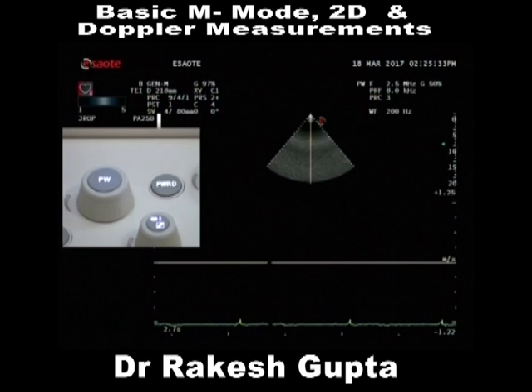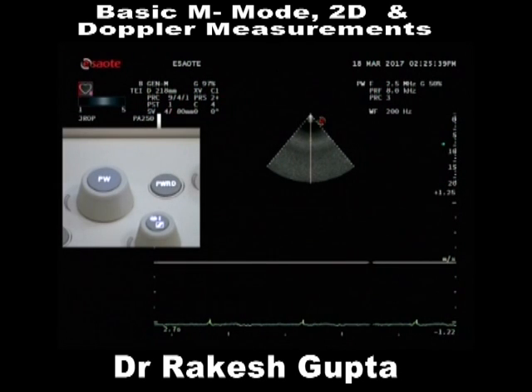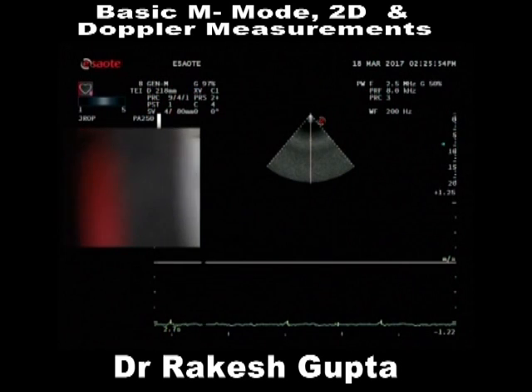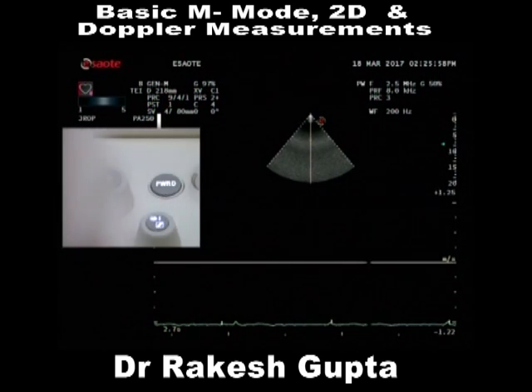This is pulse wave Doppler. Pulse wave would be used, as Parashar said, for a selective place. Suppose I want to measure a velocity at this particular point, I will be using pulse wave. Suppose I want to measure a velocity across this whole line, it will be continuous wave. Pulse wave will be able to measure low velocities. Continuous wave will measure high velocities.